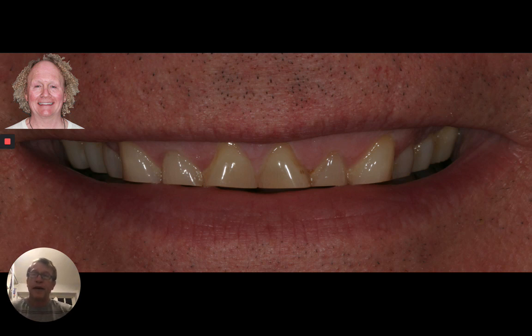And we'll also talk about, if we want some extra information, how we can combine some of this simple stuff together with face scans, maybe some jaw function like Modjaw, intraoral scans, CBCT scans, and how we can combine all this information to create a virtual patient such that we can share that information not just with the technician, but also maybe with our implantologist and orthodontist, so that we can work on a real virtual patient to get the best possible results that we could possibly have.